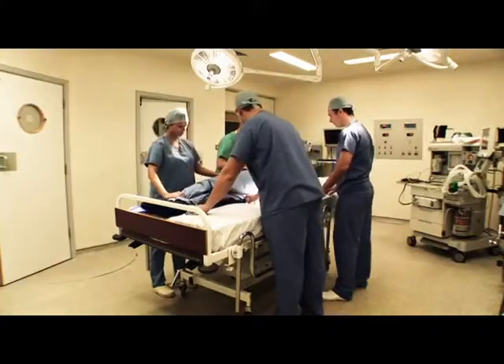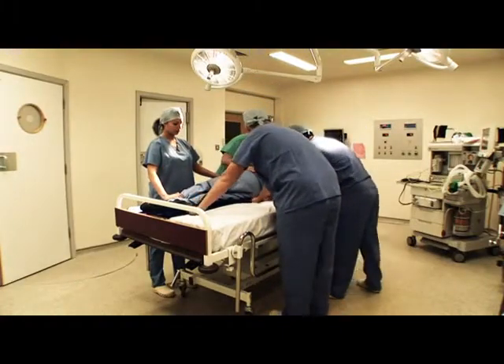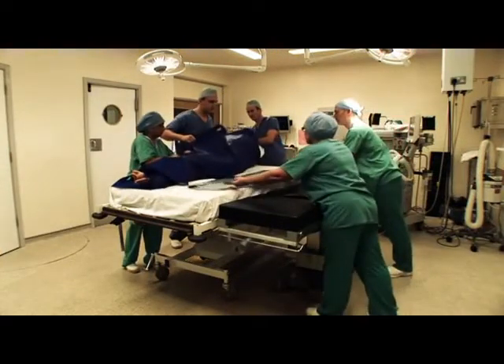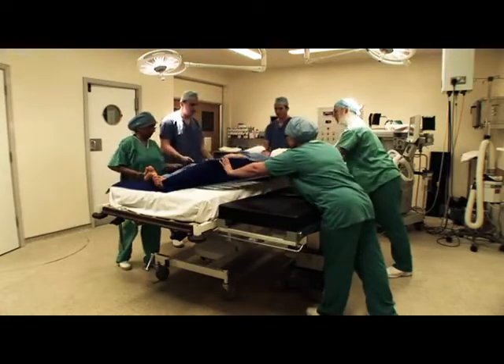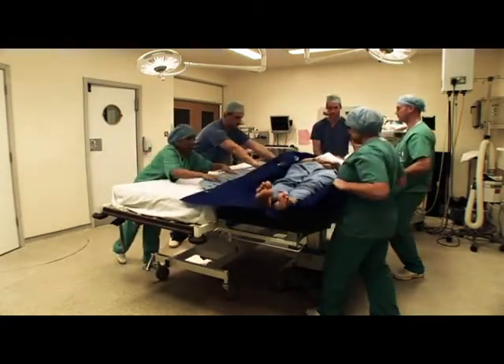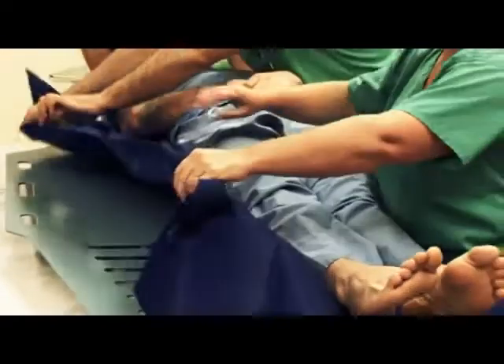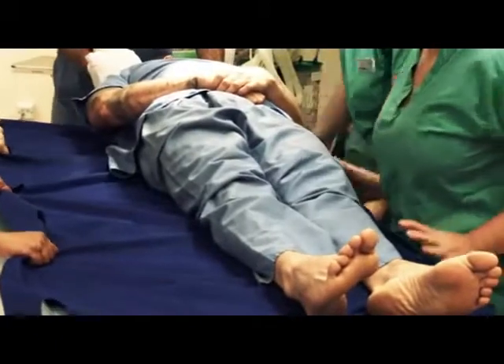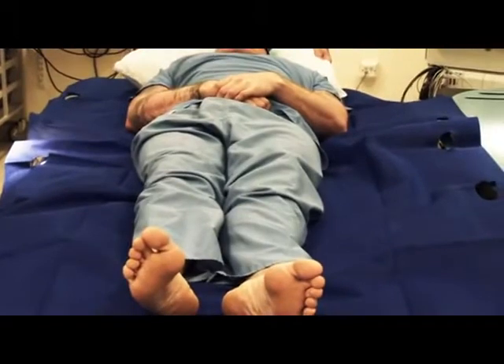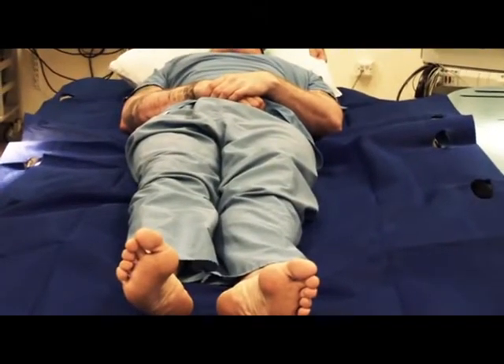Ideally, there should be two theatre staff on either side of the patient. When moving the patient between two surfaces, best practice is to have two members of staff on either side, with one person supporting the head. To aid easy transfer, apply the brakes of both trolley and operating table and ensure the receiving surface is slightly lower. FlexiSlide should be used in conjunction with a PatSlide, which is used as a bridging agent between the two beds. FlexiSlide is not designed as a replacement for a PatSlide.